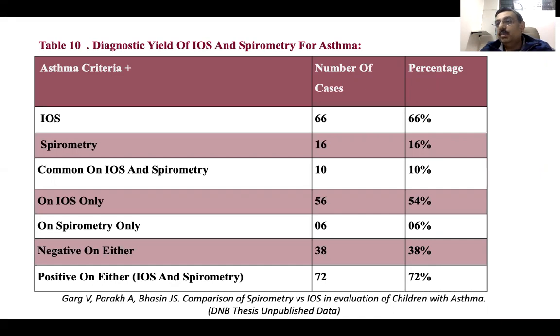So we now tend to do oscillometry first, then do a spirometry. It hardly takes us 2 more minutes to do that. And then we try and look at the reversibility and report both of them together. As we have gone through, we might have done approximately 400 to 500 patients after the thesis. And we have realized that there are groups of patients where the spirometry is abnormal but the IOS is normal, and groups of patients where the spirometry is normal and the IOS is abnormal.